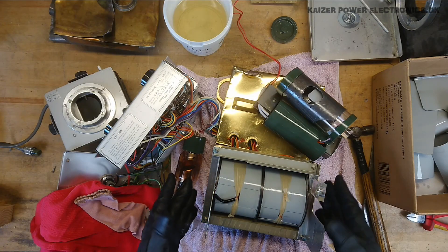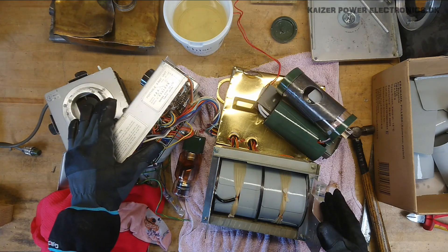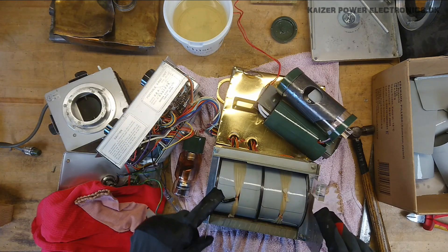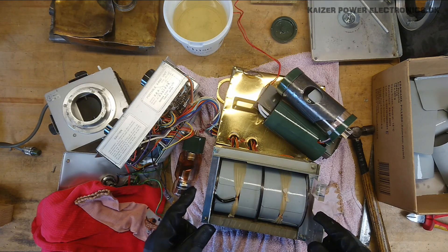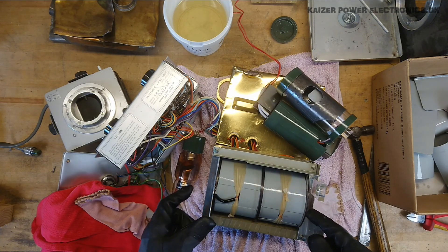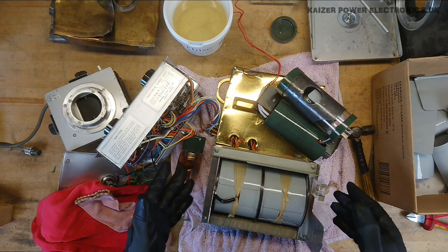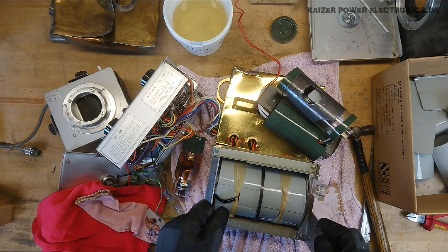For a future project, I think I will actually keep the controls here along with the transformer, get this built into another box. You can argue it's one hell of a job to take apart an oil-filled transformer just to rebuild it into another oil-filled transformer — but I wanted to get rid of all the filament transformer, the x-ray tube, all the stuff I do not need.